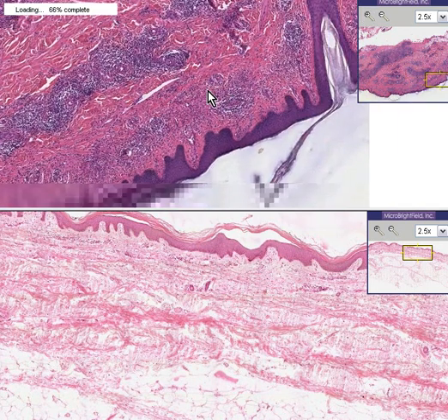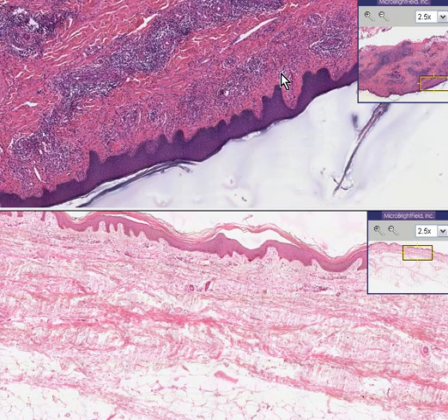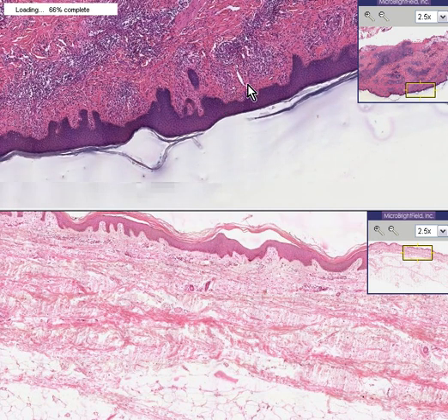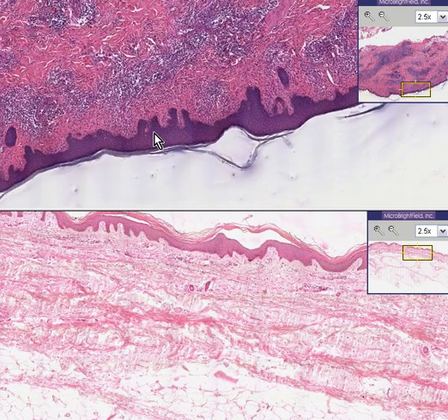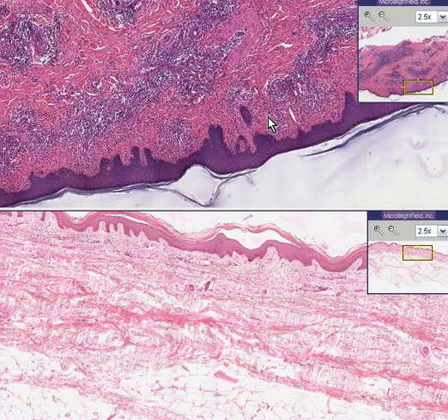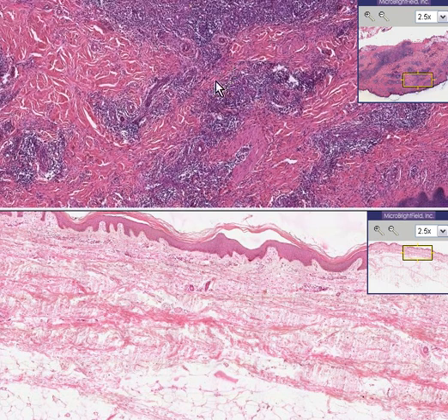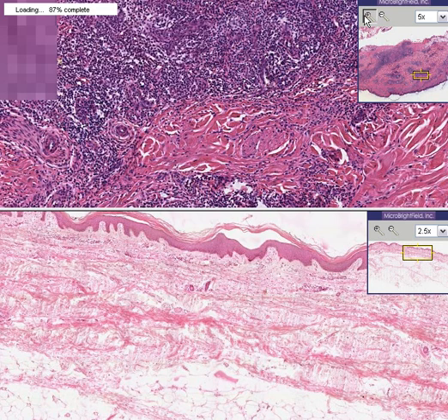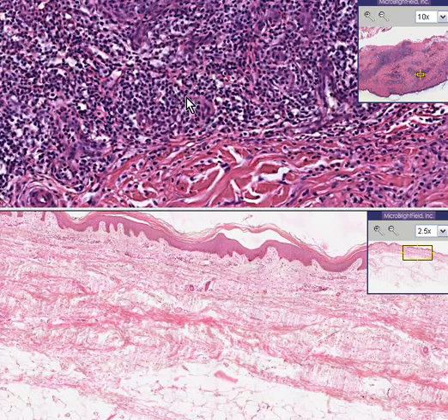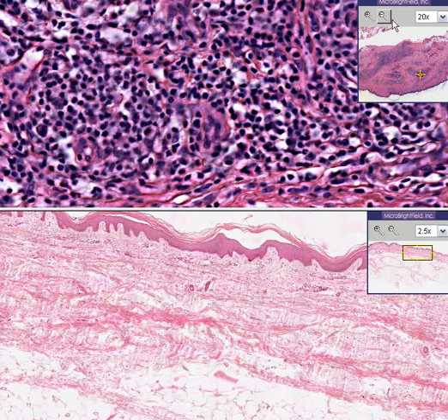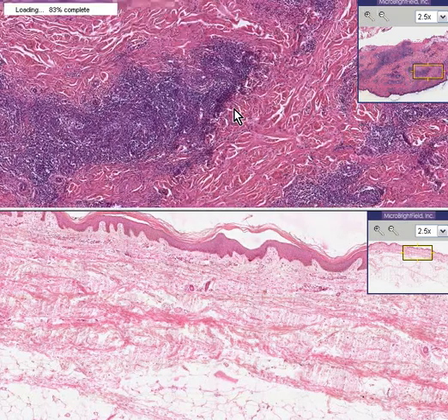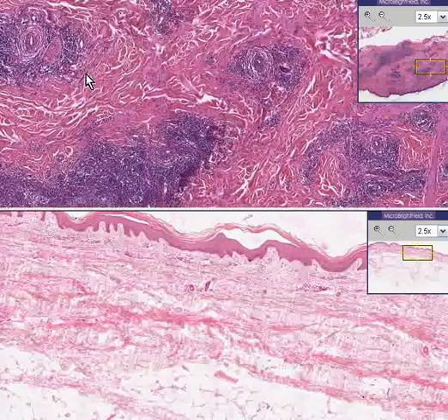In all honesty the epidermis itself does not look too bad. It has a nice wavy appearance and there's a little bit of a stratum corneum. But starting in the papillary dermis and extensively throughout the reticular dermis are these infiltrates of blue cells, which in close up are all lymphocytes. This is extensive multifocal lymphocytic infiltration throughout the dermis, causing thickening of the dermis as well.